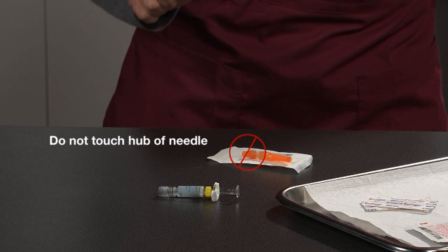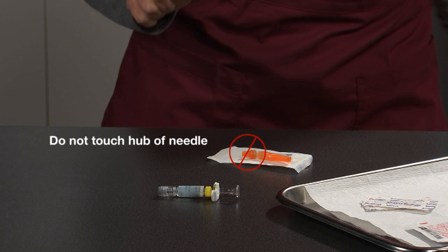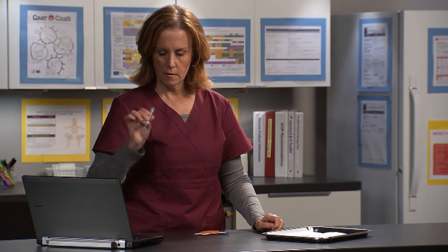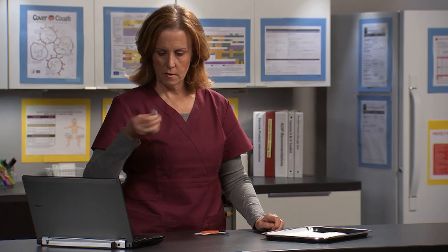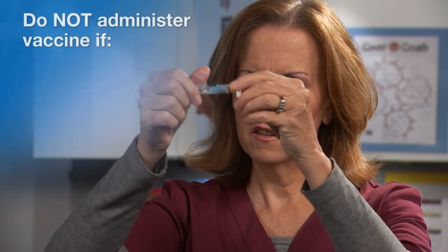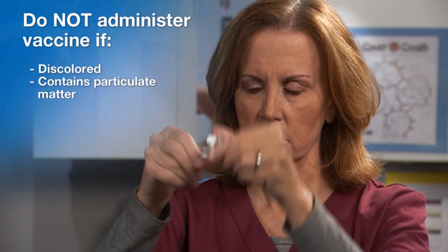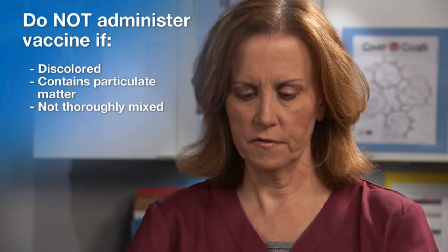The hub is where the needle attaches to the syringe. Pick up the syringe and shake it to mix the vaccine. Check the vaccine to make sure it is thoroughly mixed. Make sure there is no discoloration or precipitate. Do not administer vaccine that is discolored, contains particulate matter, or is not thoroughly mixed.